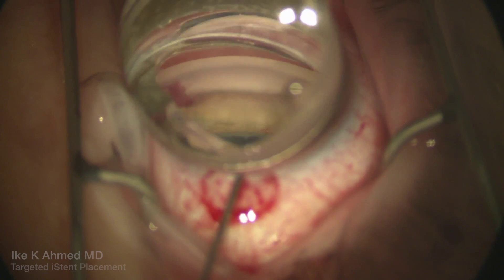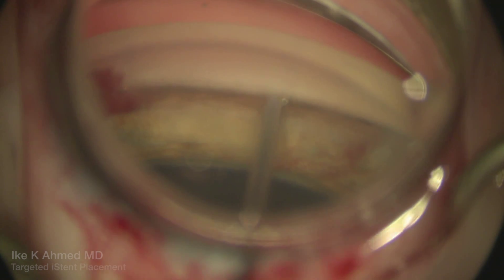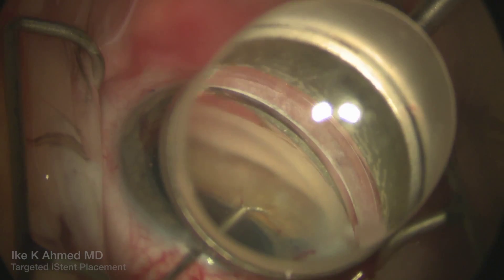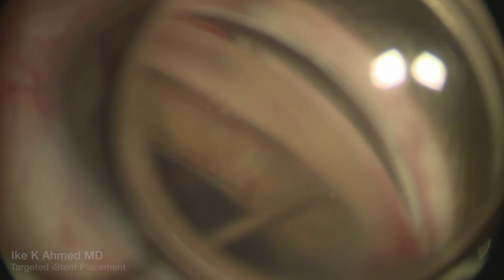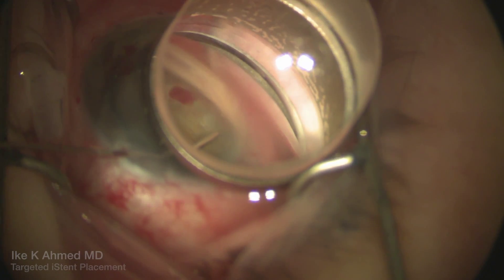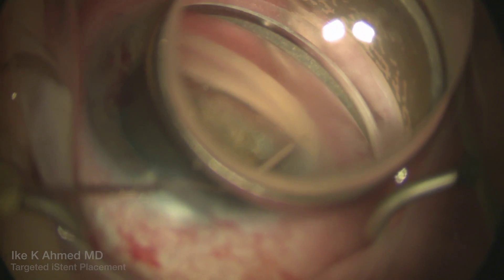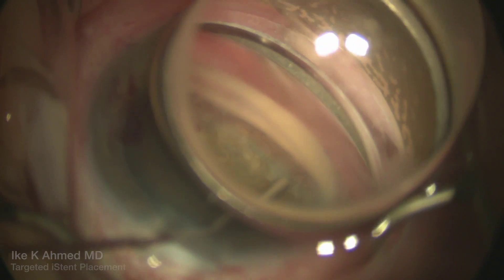Our second iStent is now being placed along the inferonasal to supranasal area, identified previously by the marking on the limbal area. This device goes in and is placed nicely within the canal, although in this case there's no immediate reflux of blood present. We'll put our third micro-stent in the supranasal quadrant, where we saw that fairly significant tangential aqueous vein emerging from the limbal area, and here we see some blood reflux emerging from that third device placement.